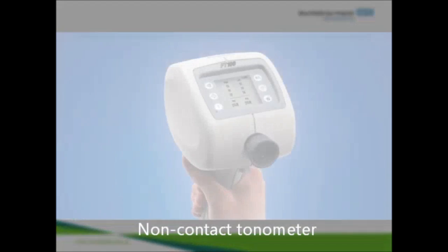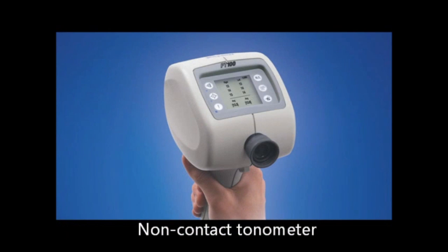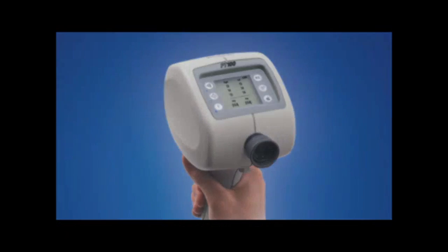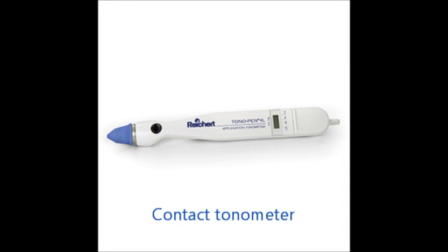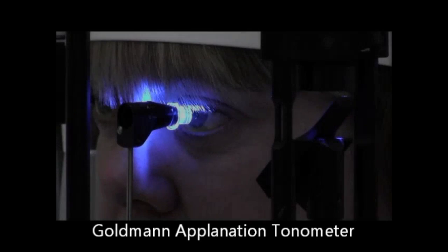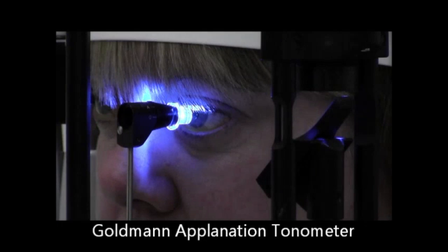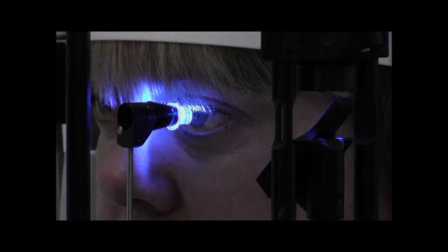There are various ways to measure intraocular pressure, including non-contact and contact devices. For the purpose of this video, we have decided to focus on Goldman-Applanation Tonometry. This measurement method is known to be more accurate than non-contact methods, since it is less influenced by other factors, such as corneal thickness.